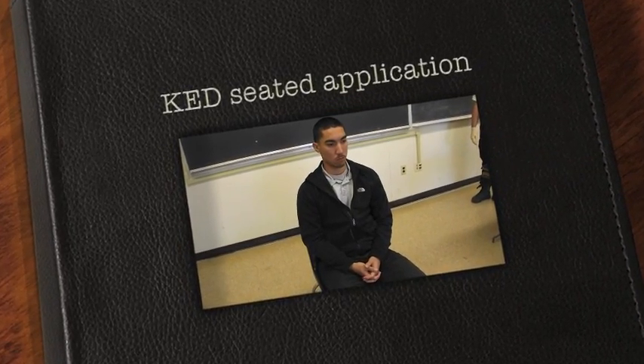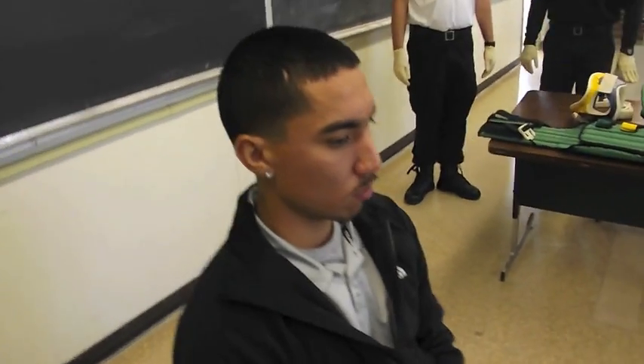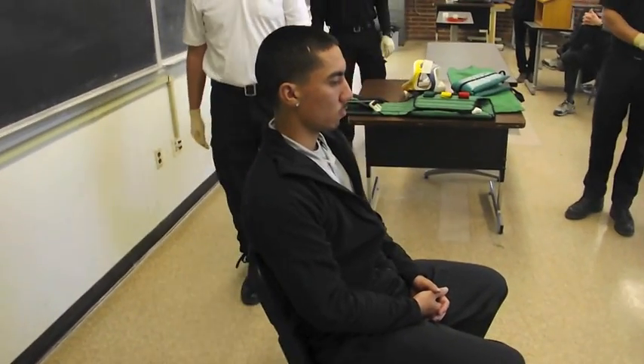Right now we're going to demonstrate the proper application of the KED. We are going to simulate that the patient has just been involved in a car accident and we're unable to have services available to extricate them.